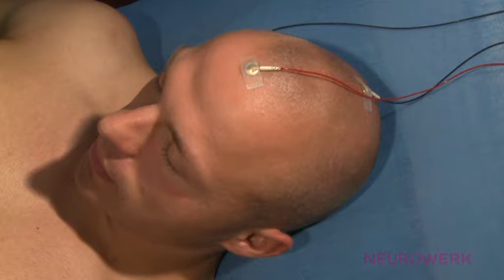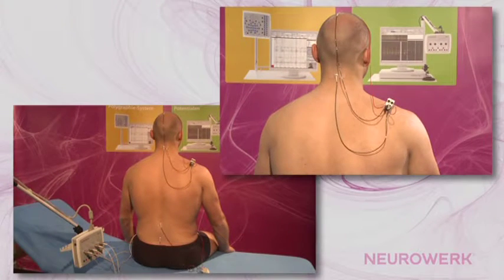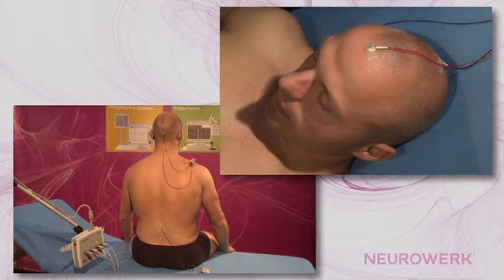The reference or indifferent electrode for channels 1 and 2 is set at Fz. Both channels of reference will be combined with a jumper cable. The indifferent electrode for channel 4 is adhered to the iliac crest. The entire examination takes place while lying down to provide maximal relaxation of the patient and to reduce muscle artifacts. The eyes of the patient should be closed and the mouth opened a little.